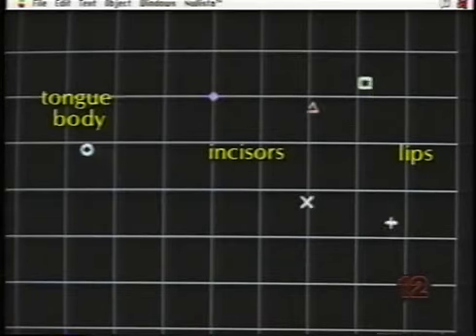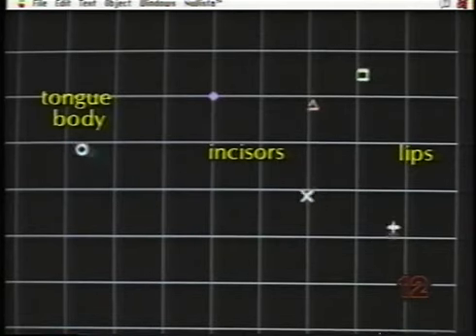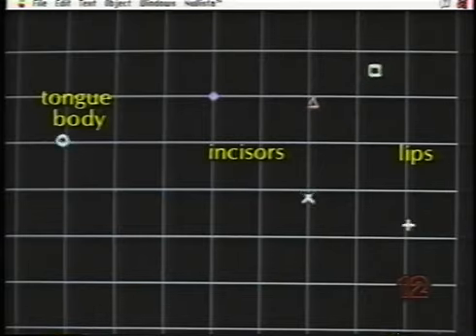At the same time, the transduced positions are monitored on a real-time display to check for changes that might indicate loosening of an attachment or excessive misalignment.